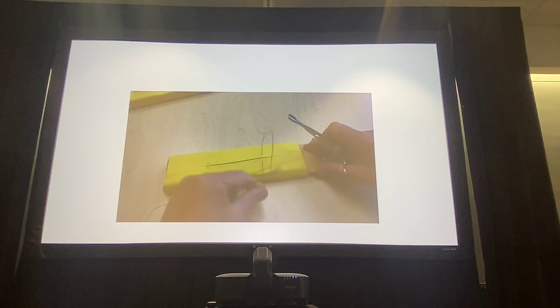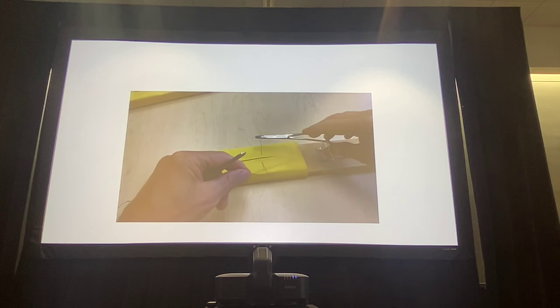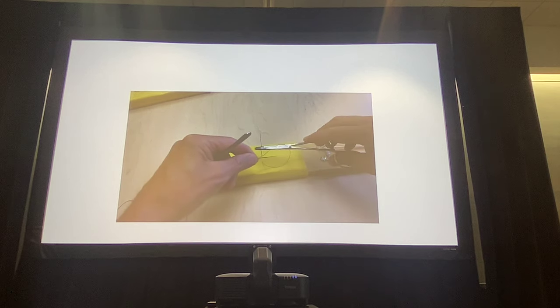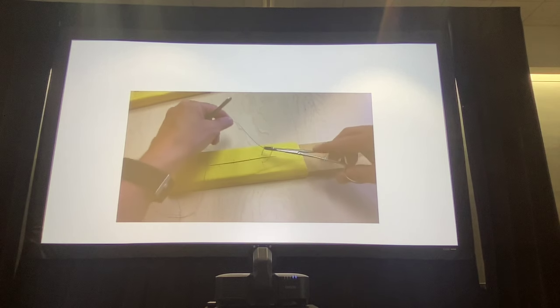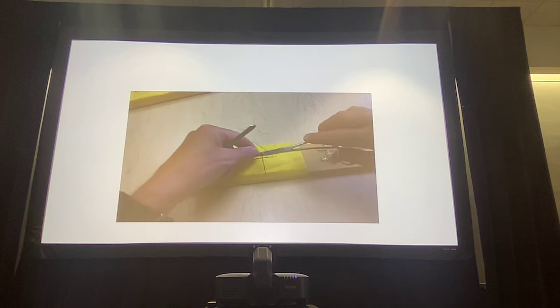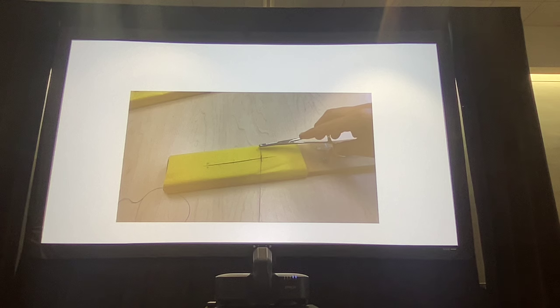How far apart you place these depends. Depends on the material, the body, where you're putting in the body. So small intestine, you want to be fairly close together. Like you want a tight seal. For skin, maybe a couple millimeters apart is fine. But you'll use your judgment. You place all your interrupteds and you'll say, okay, you know what? I don't like this gap here. Let me put another one or two in here. And so you sort of fill in the blanks as needed.